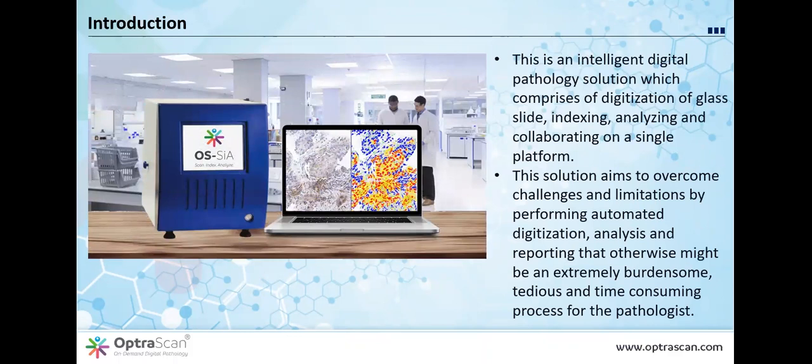Moving forward, a quick insight to our end-to-end PD-L1 solution. This is an intelligent digital pathology solution which comprises digitization of glass slide, indexing, analyzing, and collaborating on a single platform. Yes, you heard that right. We have a solution which can not only digitize your slides, but analyze, interpret, and help the pathologist read them.